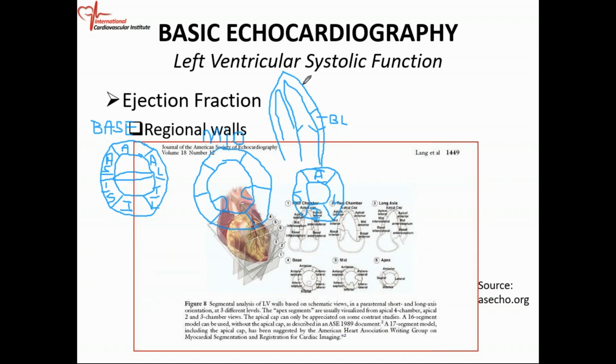Further up, you have the mid. So this is the mid-lateral wall right here. And then this segment is close to the apex, so we call this apical lateral wall. So this is the apical lateral wall.